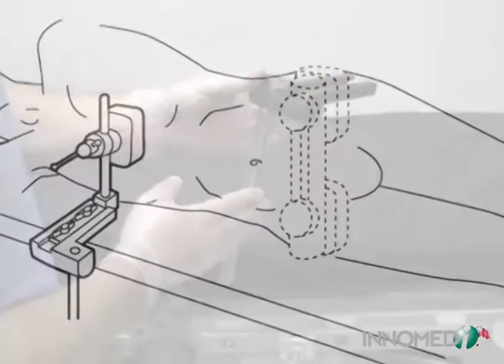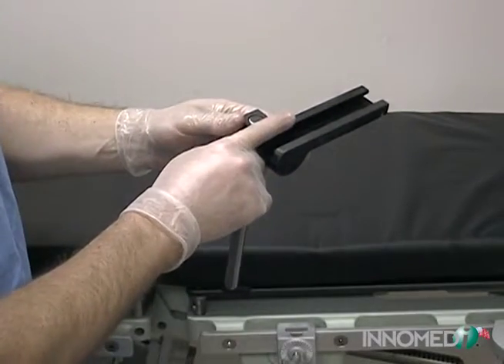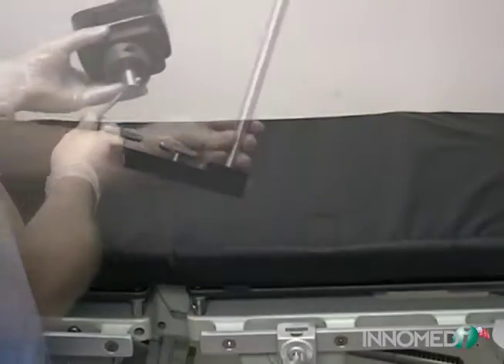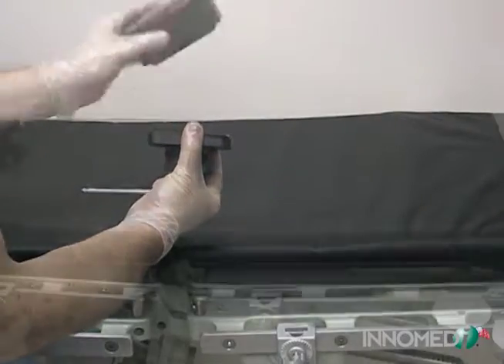The Wixen Stuhlberg anterior trunk support consists of one table attachment which utilizes existing table clamps, one base slider with stainless steel upright, an adjustable pad block, and a foam pad treated with a cleanable coating.